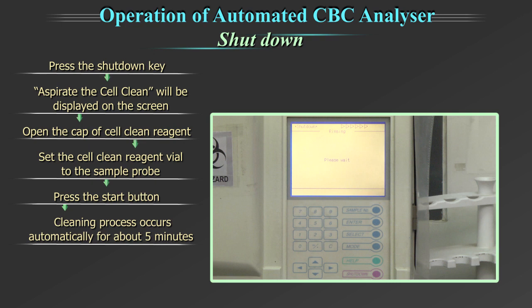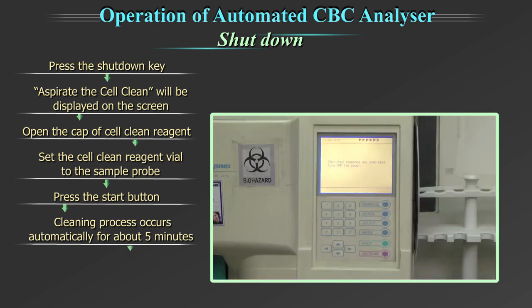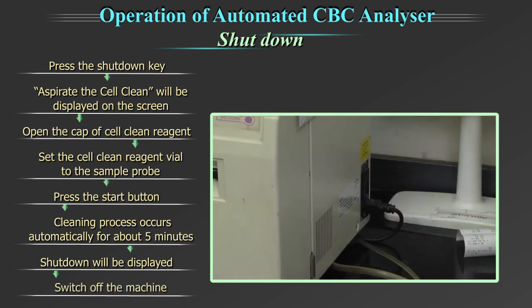The cleaning process occurs automatically for about 5 minutes. After completing the process, shutdown will be displayed on the screen. Now, switch off the machine.